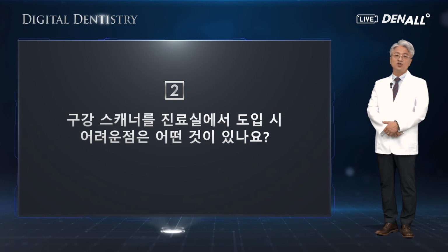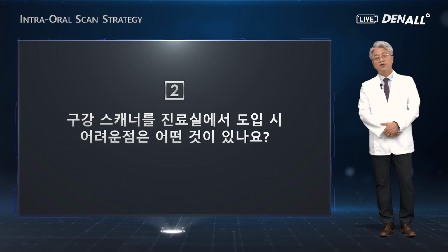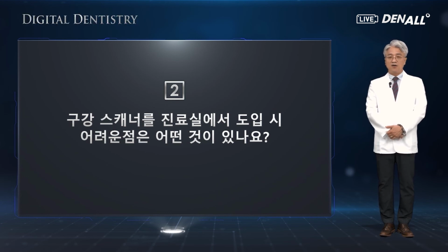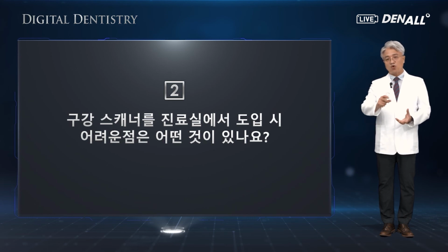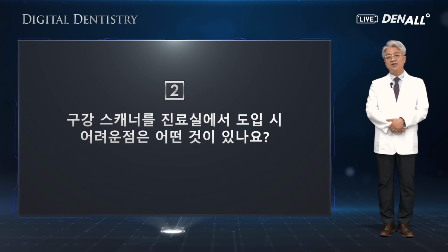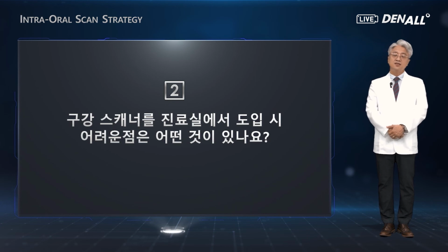The next question, in adopting the oral scanner in the clinic, what are the barriers? When the intraoral scanner is adopted in a clinic, the most difficult part would be the learning curve for people to get used to it. Dentists and staff, both of the professionals need to understand the new technology and apply it clinically. So some efforts need to be exerted by both parties to get used to it.